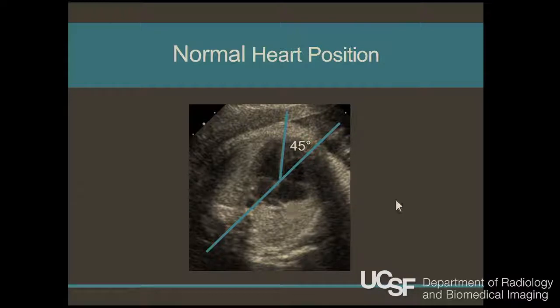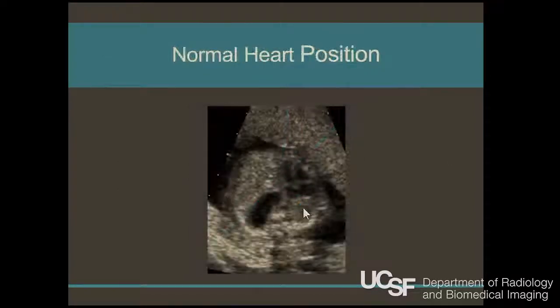That's your first clue. If you notice back here on this, well, here, actually, I'll go here. So if you draw your line here, the heart is basically completely shifted to the right side of this line. But what I wanted to point out was that this is liver, this is lung.